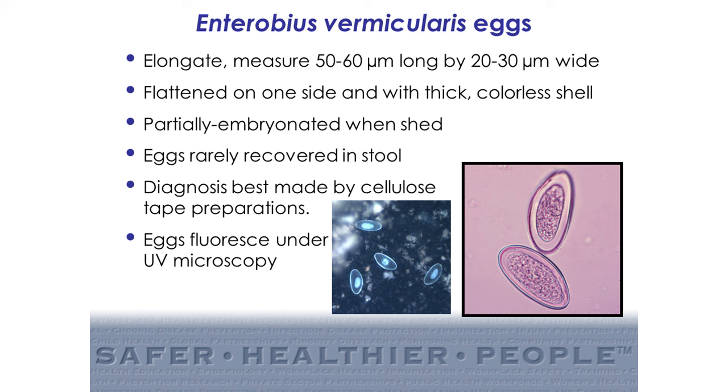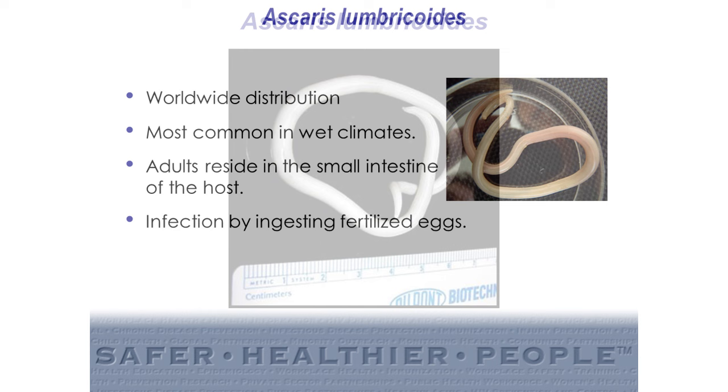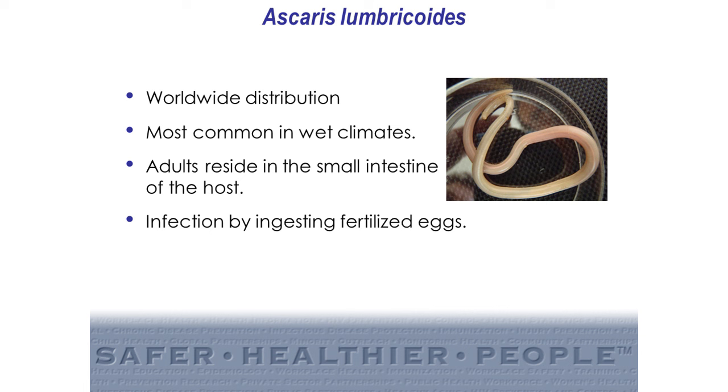Under UV microscopy, pinworms can fluoresce, as shown in the image here, with a bright blue fluorescence. We next move to Ascaris lumbricoides. Ascariasis is the most common helminthic infection worldwide. It is most common in wet climates.